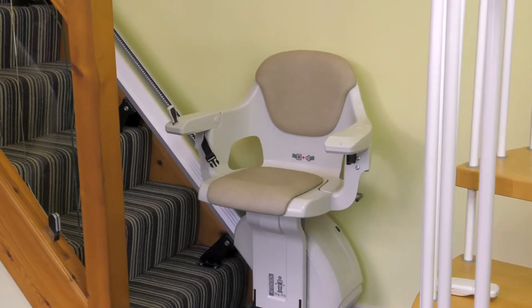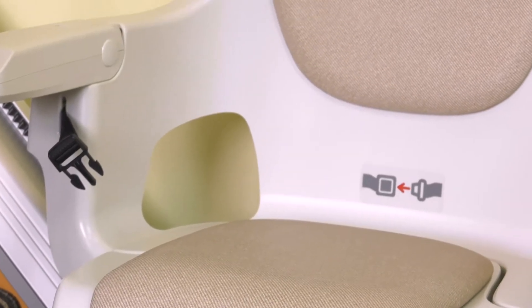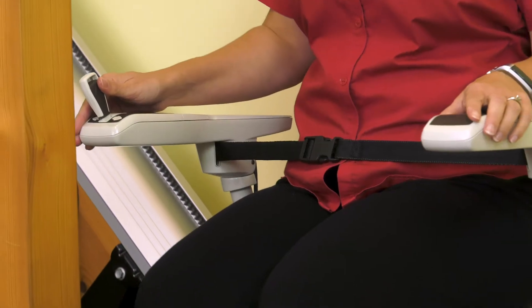Which straight stair lift is the best if you just need a basic model to get you up and down stairs? The Home Glide may be perfect for you. It's well made with high quality engineering, it's reliable and very easy to use.